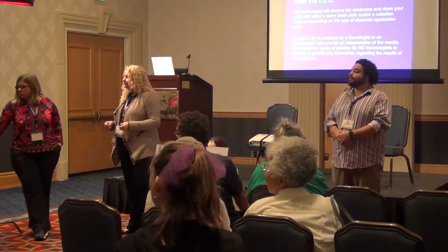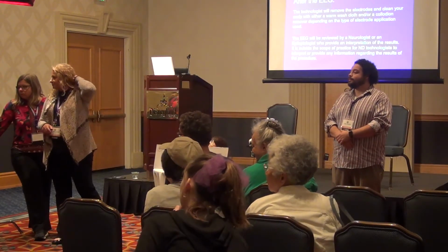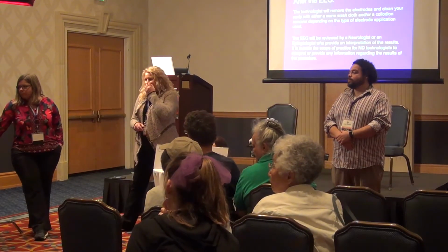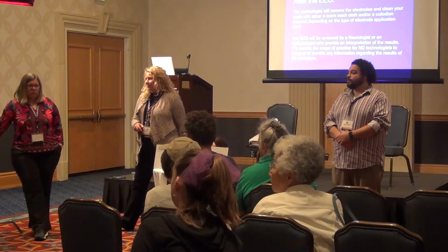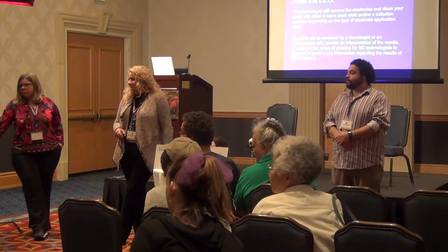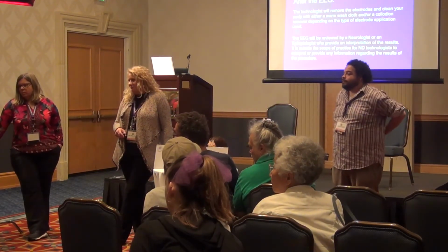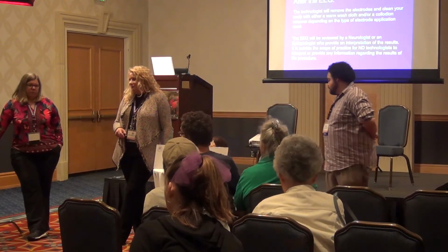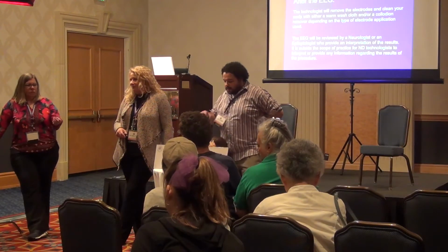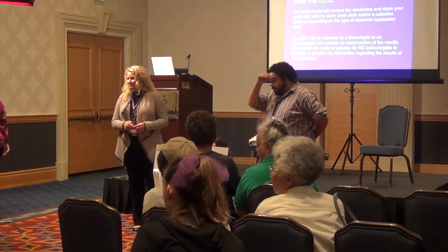Excuse me. Yes. I'm the next speaker on the EEG. I want to show you, this is not like a meditative exercise. This is to induce an abnormality. You are going to deliberately breathe very deeply and very fast. The idea is to get your carbon dioxide in your system much lower than normal. Some people would get a little dizzy when they do that. But it's not normal, healthy, wholesome exercise. We are trying to bring out abnormality.